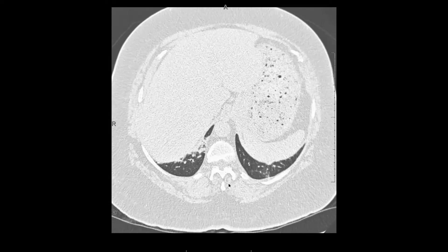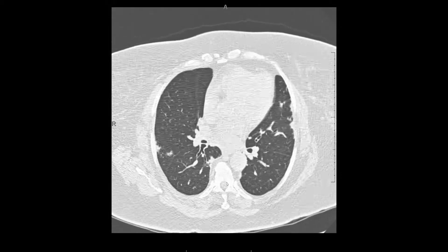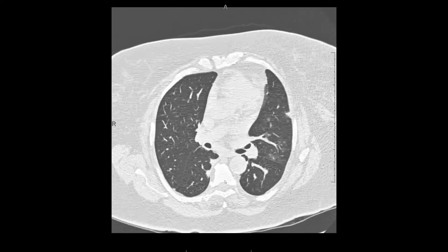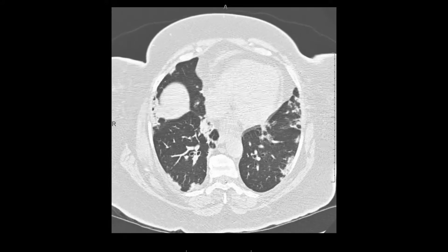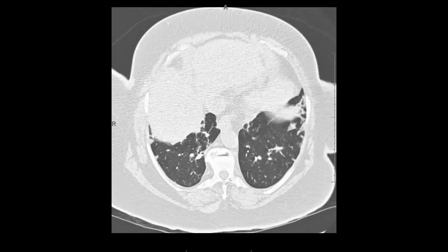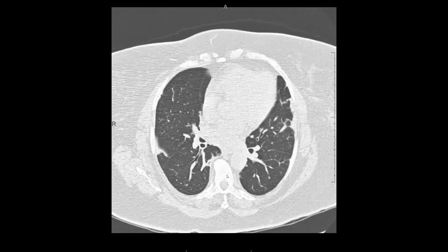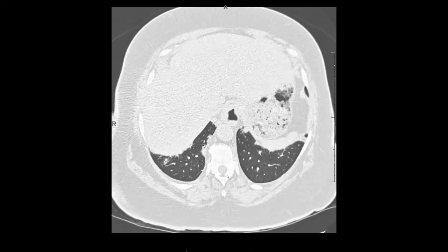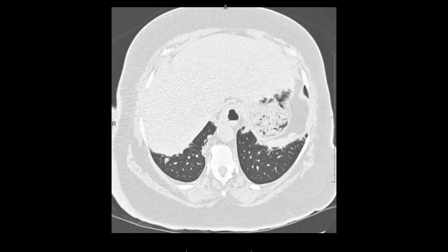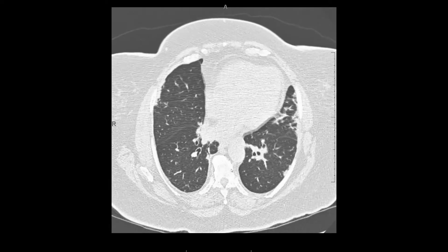Here's a nice ILD case. In this patient, we see basal predominant consolidation within the lungs. I think people tend to discount pulmonary opacity as nonspecific, giving simple differential diagnoses of aspiration or pneumonia. It's 'white stuff in the lungs' and it can be difficult to figure out the etiology, but clinical correlation is helpful. In certain situations like this, especially when it's bilateral and generally symmetric, you can be more specific.